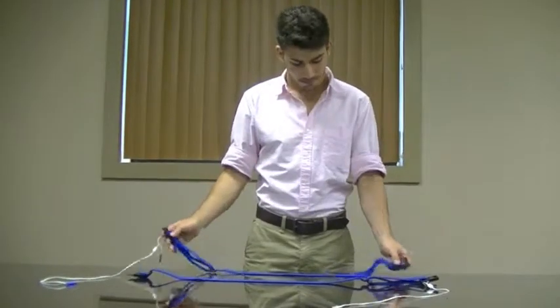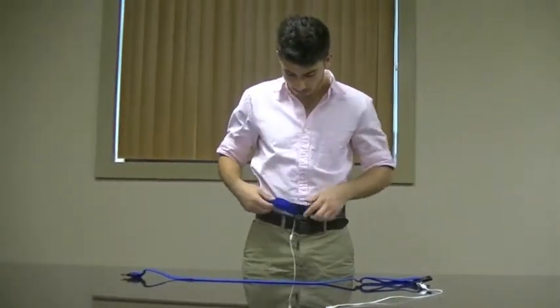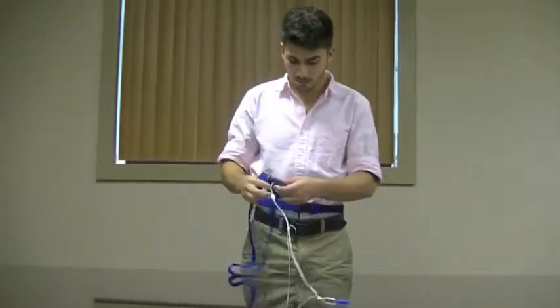Next, you will need to attach the two blue straps. These straps are the exact same. One will go around your chest and the other will go around your waist. You may want to adjust these for your own comfort.